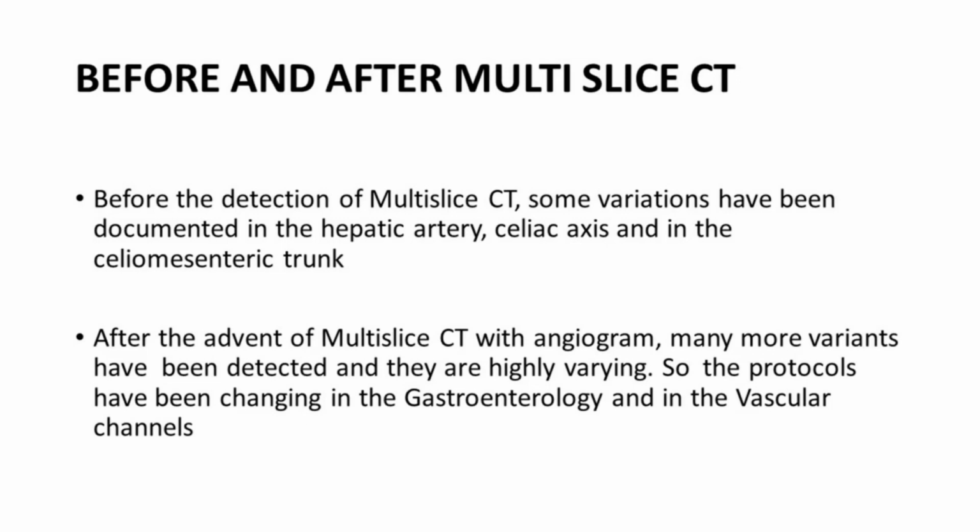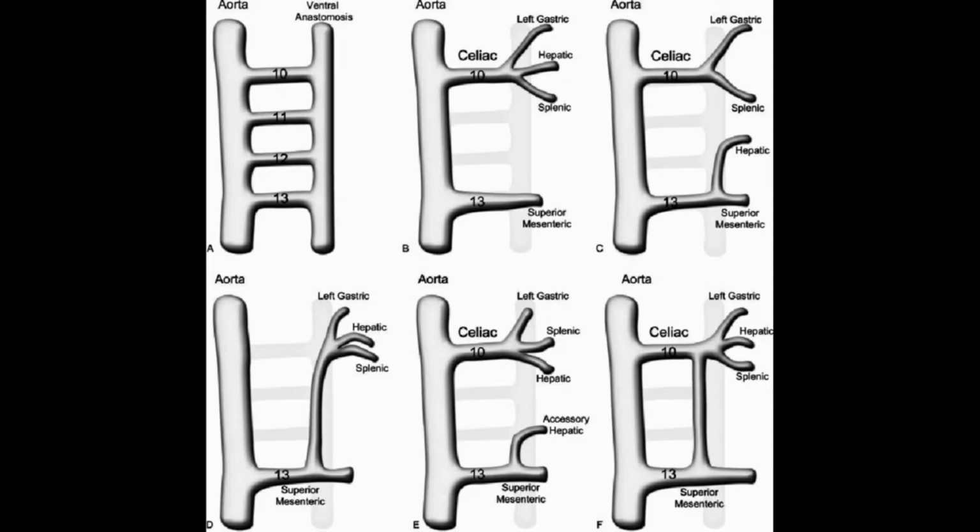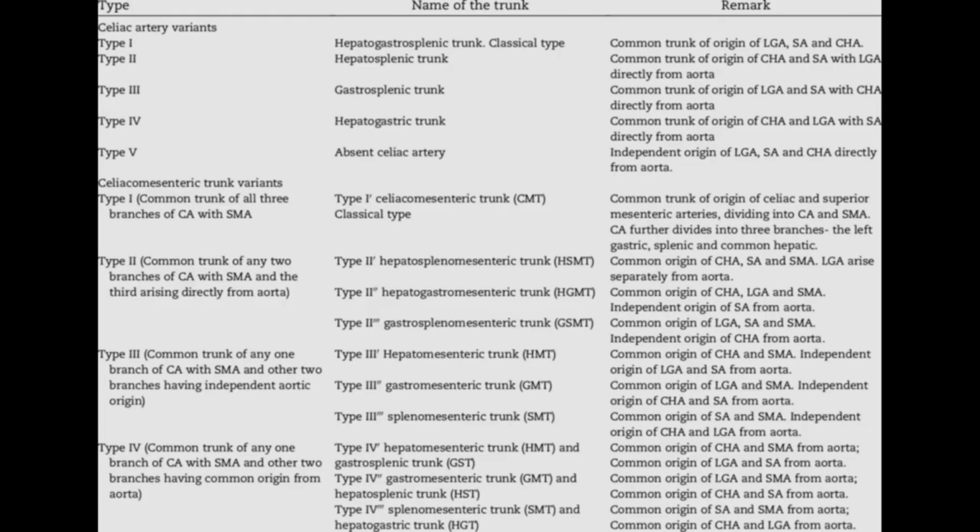This information on imaging may be crucial to the surgeon preoperatively in major upper abdominal surgery such as Whipple's procedure. Information about hepatic artery variants could also be very useful preoperatively, the more common surgery being cholecystectomy. It is very easy to diagnose the celiomesenteric trunk on any imaging, but not easy to diagnose the variants in the smaller hepatic artery and its branches.